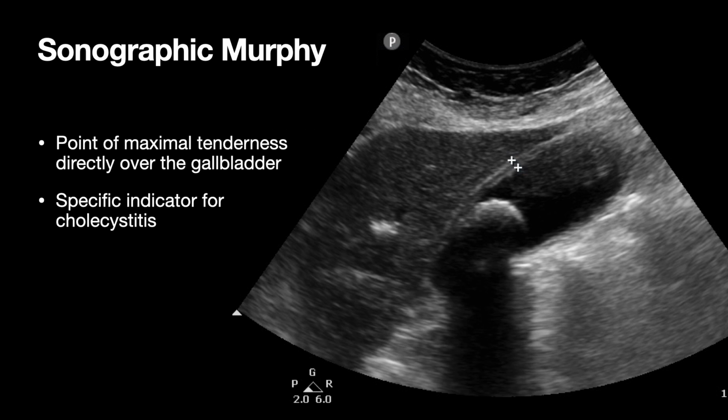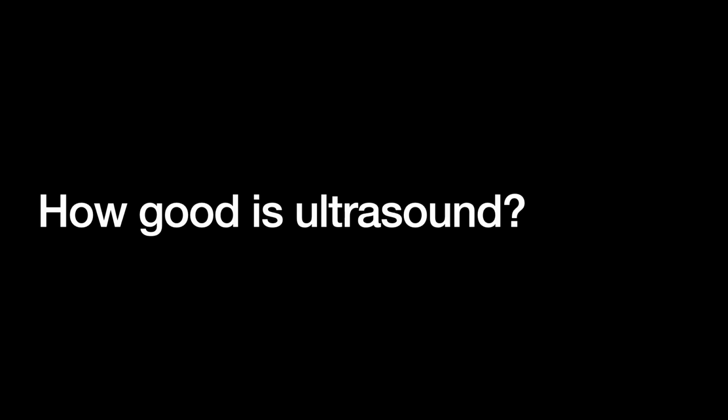So the question then remains, how good is my ultrasound? Can I trust this? Can I trust me doing this, right? We talked a little bit about what cholelithiasis looks like, what cholecystitis looks like. That's all on top of the foundation last time of what a normal gallbladder should look like. But now, as I take this to the bedside, can I feel justified doing this for my patients? Am I providing some benefit, or only interesting myself from an academic standpoint?